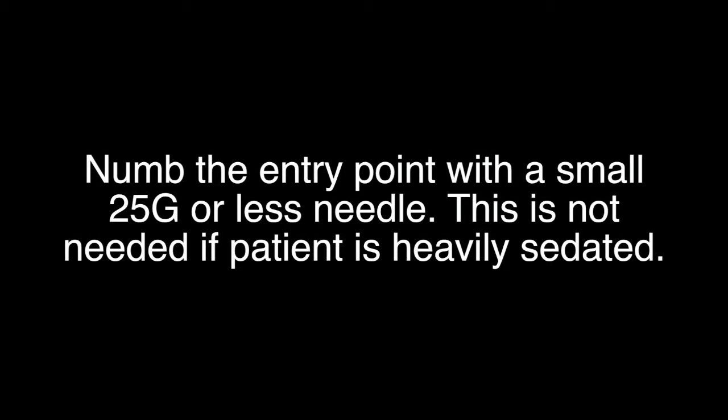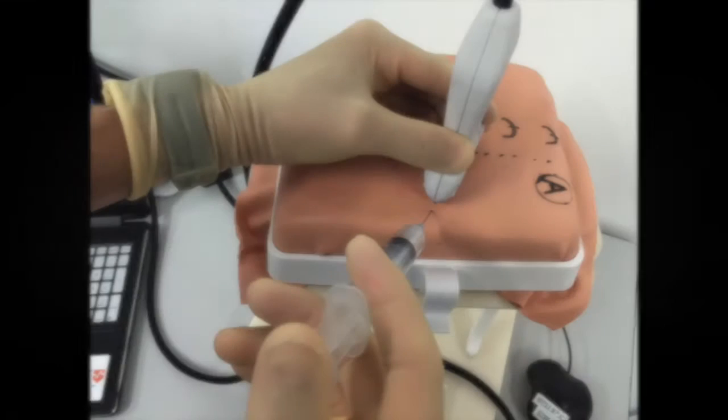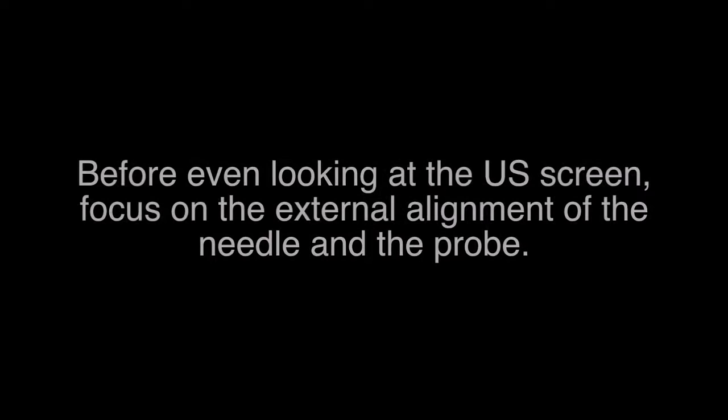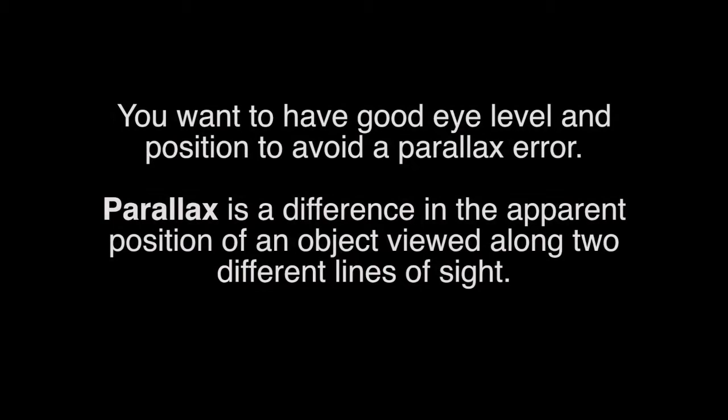Numb the entry point with a small 25 gauge or less needle. This is not needed if the patient is heavily sedated. Before even looking at the ultrasound screen, focus on the external alignment of the needle and the probe.